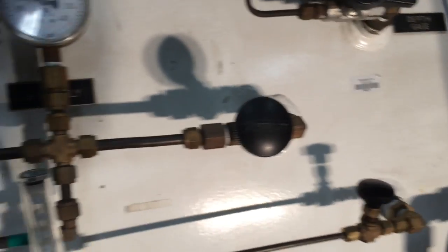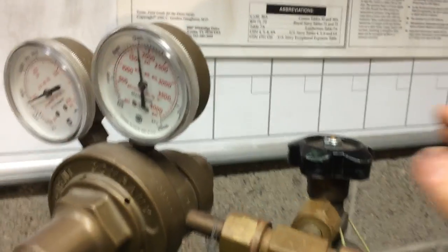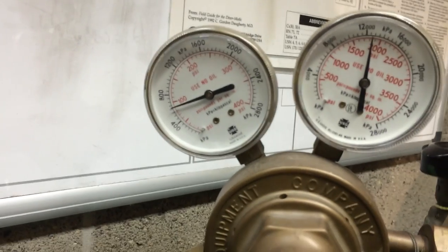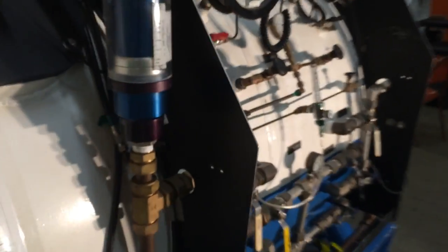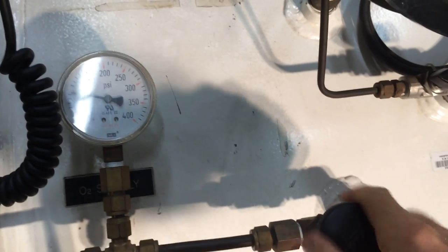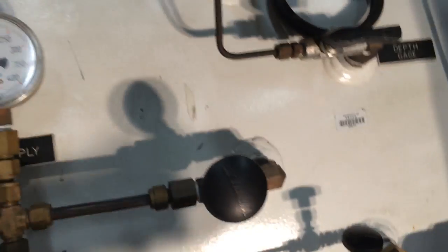Now we're going to test-breathe the bib masks for the outer lock. We verify our online cylinder is on — we just turned it on. We have bottle pressure and the regulator is set at 90 psi, a little high for surface testing but it will still work. We come over to the chamber, where the oxygen is fed up to the manifolds, and open the outer lock oxygen supply, delivering oxygen inside to the chamber.